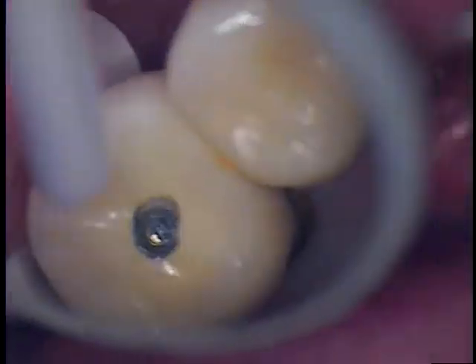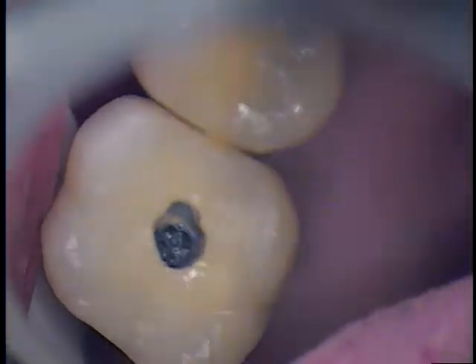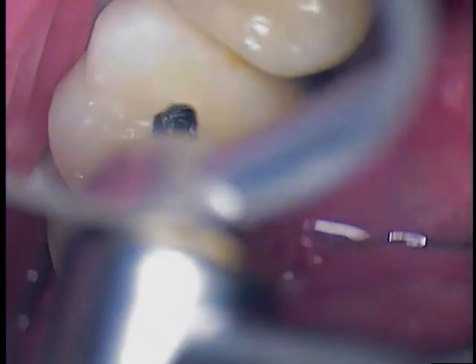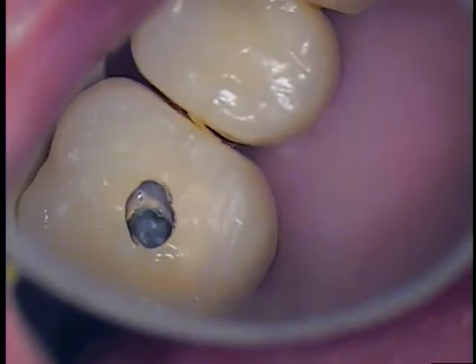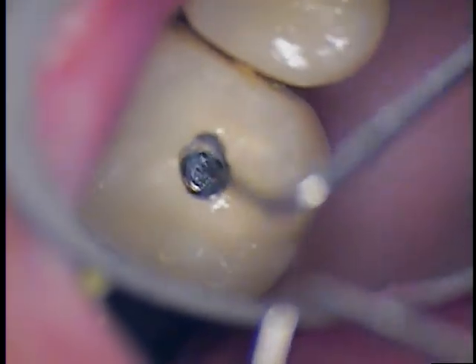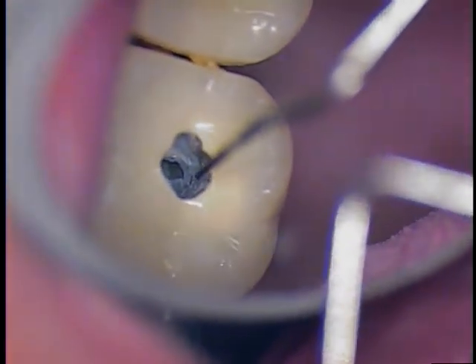Are you all right? Okay, let me know when you need a break. And we're going to measure the depth — so about six millimeters in depth. I'm just trying to get a gauge for how far and where we're heading.